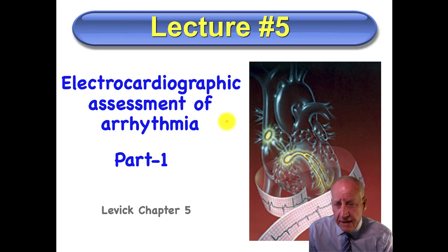So far we've learned that the EKG waveform is generated by the spread of electrical excitation through the heart. Voltage sensing electrodes on the surface of the chest record the cardiac electrical vector as it shifts in a very predictable way, kind of like a lousy golf swing over the cardiac cycle. And this simple waveform is jam-packed with important information.